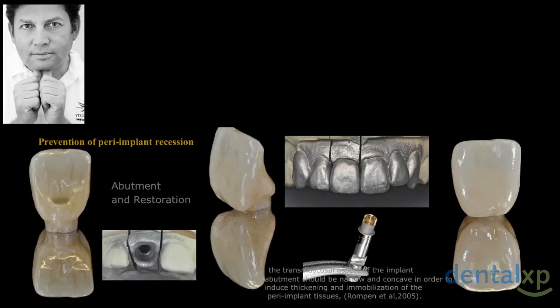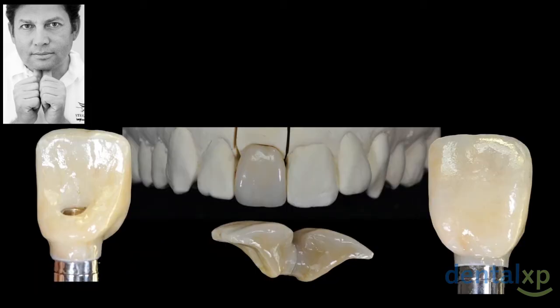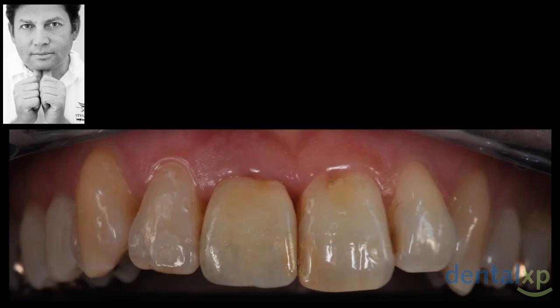So in a case like this, after everything is prepared, this is what we do. You see in the cast picture the soft tissue thickness which will be there. That's the border. And now it's my decision if my abutment is going to be concave, straight, or convex, according to the research we did. And this is going to be a concave emergence profile because I placed the implant slightly buccal. This is when we delivered it. And please take a look at the zenith.